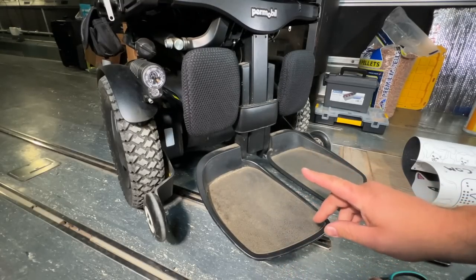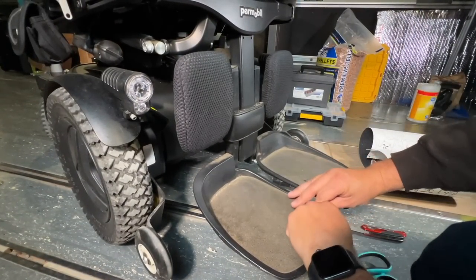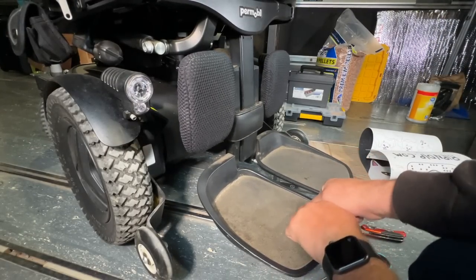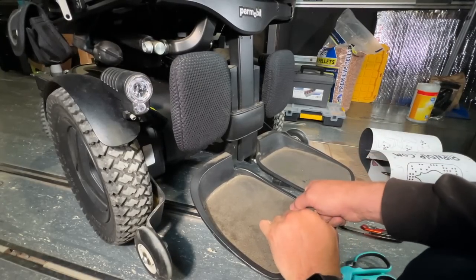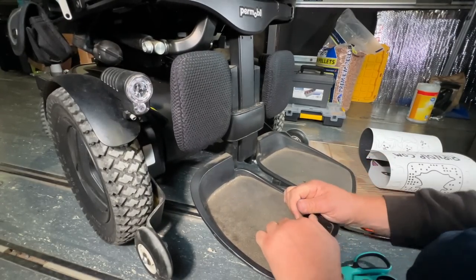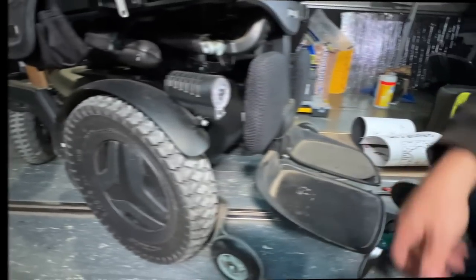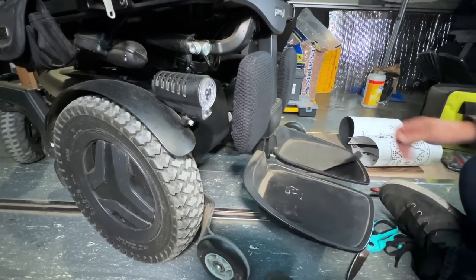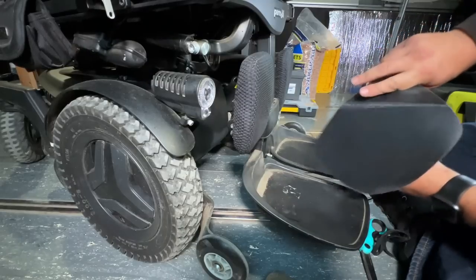I do have a hairdryer back there, although I'm already on the floor. I don't really feel like getting back into my chair again — by the way, the backrest is now reinstalled and it doesn't squeak anymore. I'm going to keep doing this by hand. I got one of them off. I'm not sure if Permobil has upped their glue game or if this is just because this chair is only a year old, but apparently it's all about gripping it and ripping it.